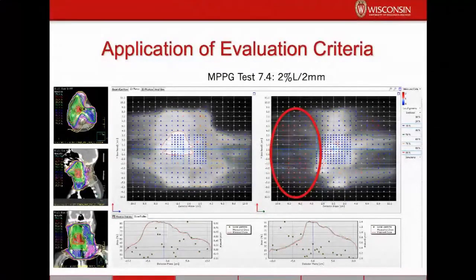Sure. Hi, Dustin. Thank you for a nice presentation. I have a question. Patient-specific QA essentially checks the treatment planning process end-to-end. Can patient-specific QA be leveraged to assure that the treatment planning system is both consistent and accurate? I'm not suggesting it as a substitute for MPPG 5 guidelines, rather that it adds to one's assurance that everything is working accurately.